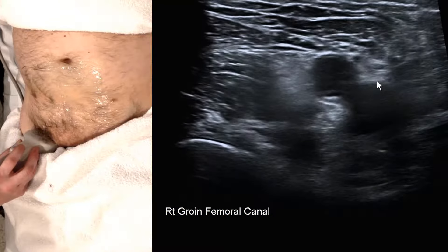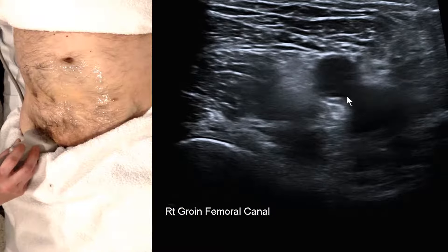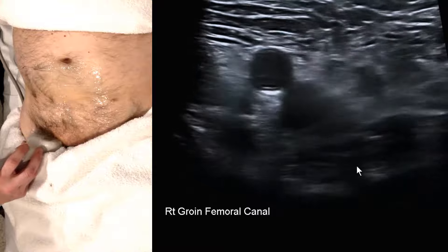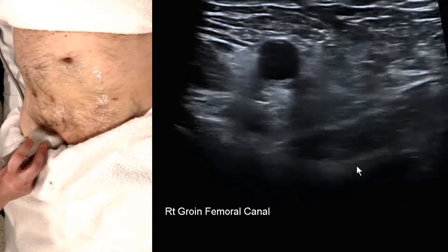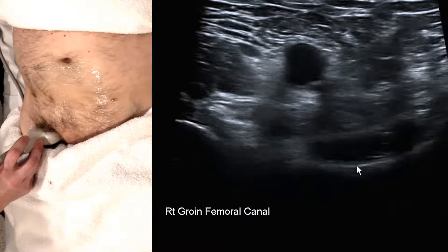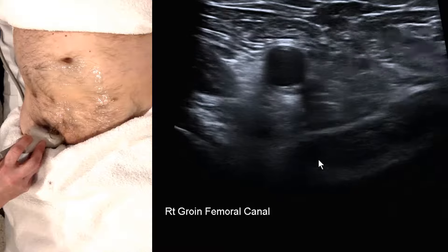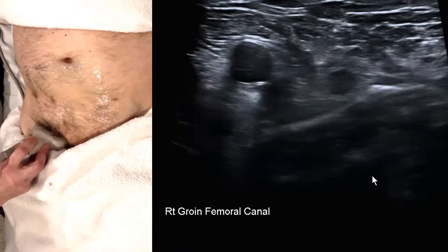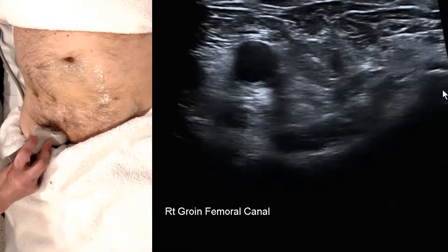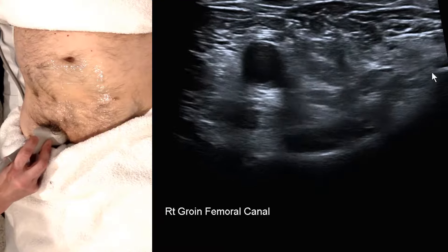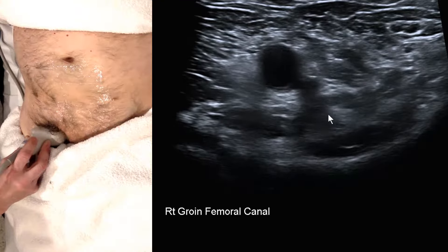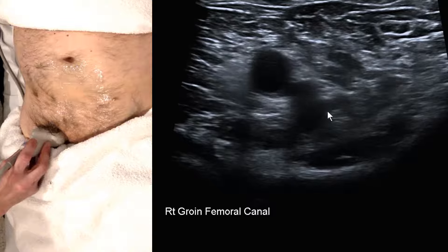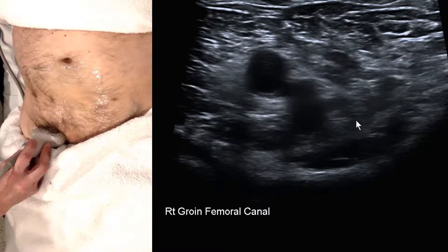We place the transducer just below the groin crease to find the femoral artery and vein. Sweeping from lateral to medial you can make out the pubic ramus behind and the pectineus muscle, which forms the floor of the femoral canal. Most importantly, find the pubic tubercle — medial to the vein, which is going to expand on strain, is the femoral canal.